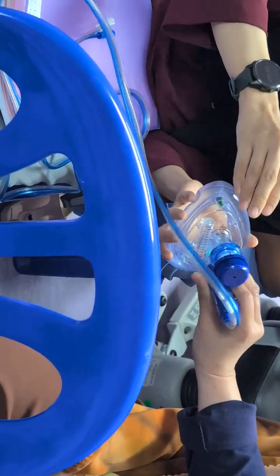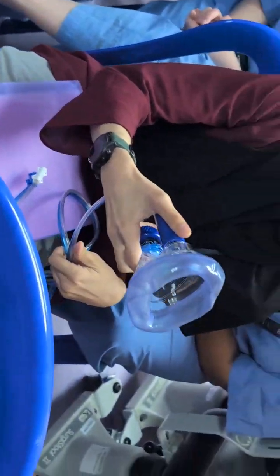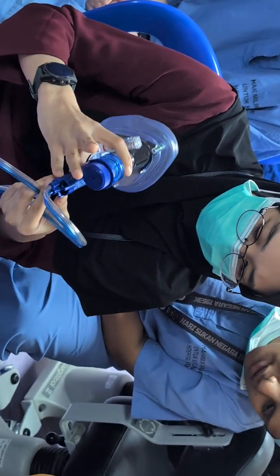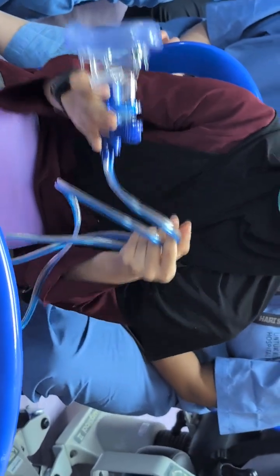Oxygen is okay. How do you strap to the patient? The strap is there, doctor. There is a usual strap. Did you bring the strap? No. Okay, never mind, it's fine. If you don't mind, can you sit down? I'll show it to you.